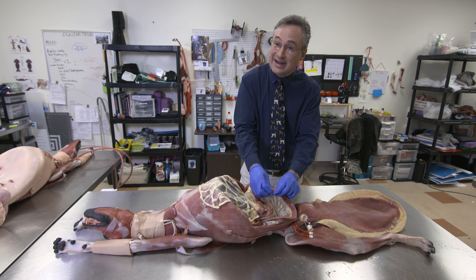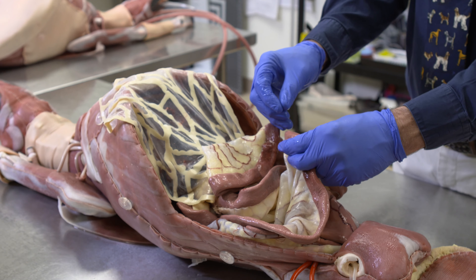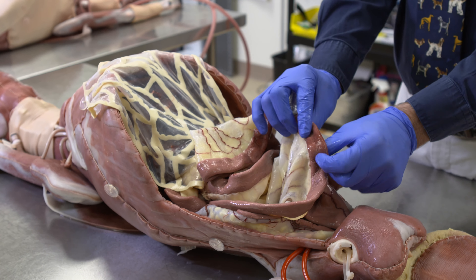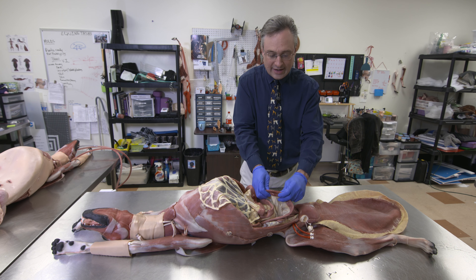It feels kind of like a dice. How would I deal with this? You would do an enterotomy — you cut, remove the foreign material, and sew it up. But there's another issue: there's a pathology, an area of irregularity, perhaps damage done by the dice.